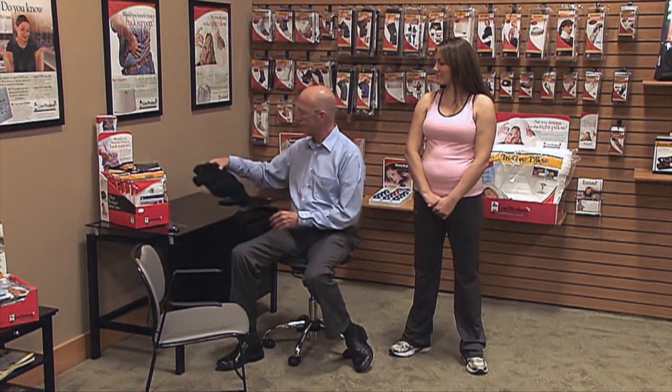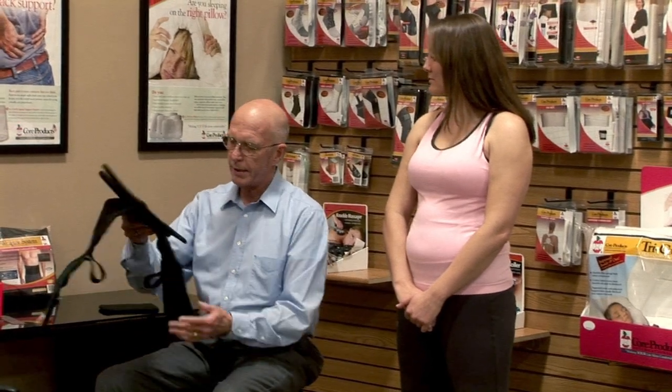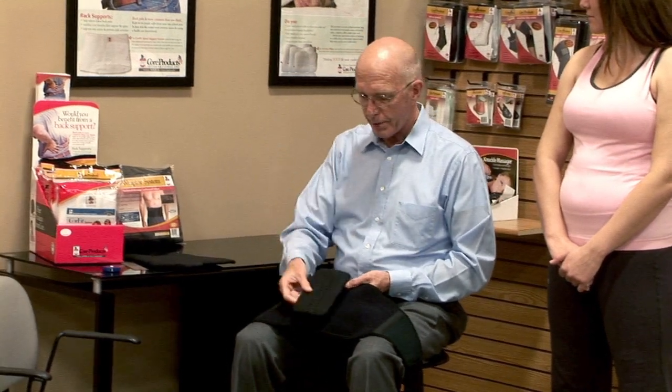Let's go through the process. The device comes with a garment portion, and there's also a removable posterior panel that can be removed for a step-down brace. A rigid anterior panel can then also be removed, and finally you're left with just the support of the system without the rigid control. So there are actually four braces in one.